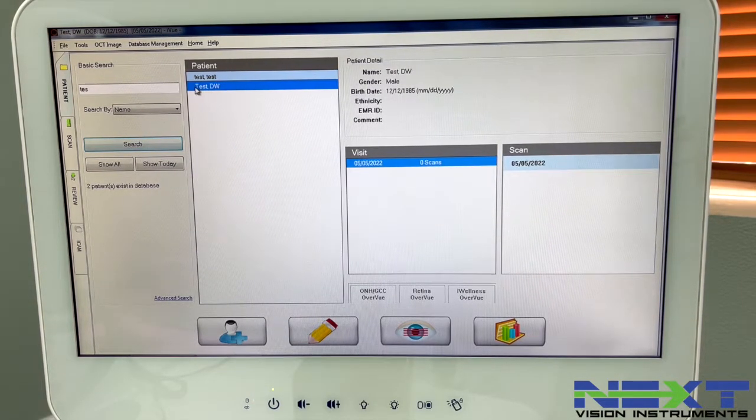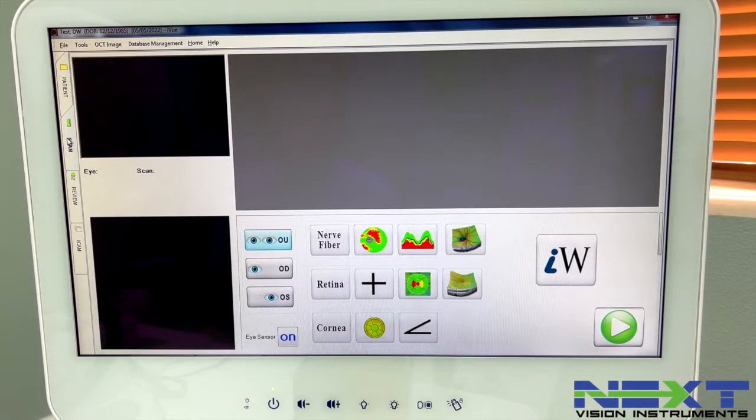The patient we just entered will appear. Go to either the scan button or use the side windows. Click the scan icon — this automatically defaults to OU. If you need to do just the right eye, click that option, or the left eye option. You can select individual scans to see them highlighted. Clicking nerve fiber layer highlights all of those scans; clicking retina highlights all of them. Same thing with the cornea — we'll get into that later. For now, select nerve fiber layer to highlight all of those and click the play button to capture.